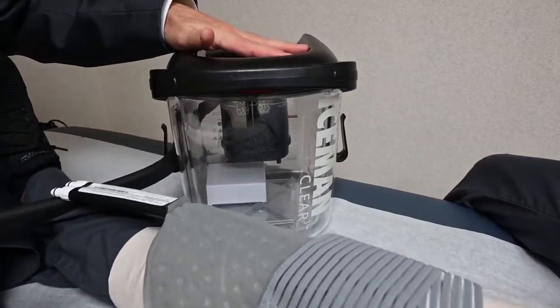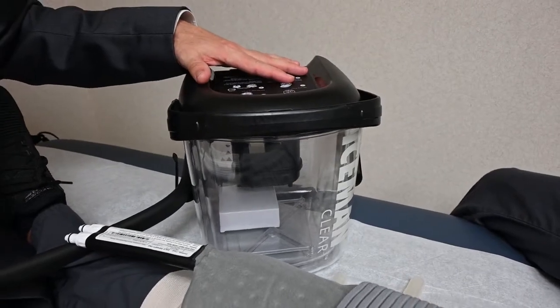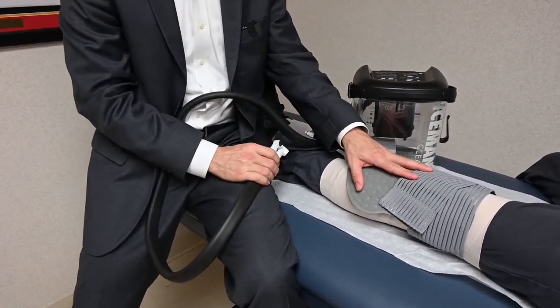This is the polar care unit that comes with your polar care. This unit is designed to fill with ice water, and then upon plugging the unit in, the unit will start circulating that ice water through the tube and ultimately through the polar care pad.